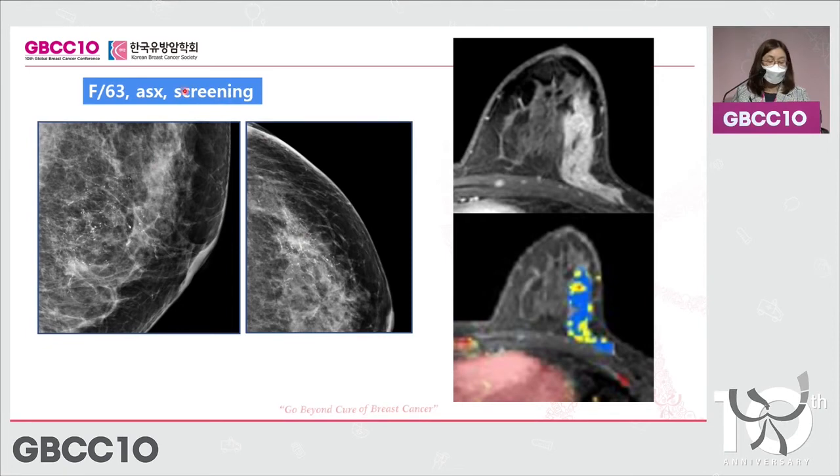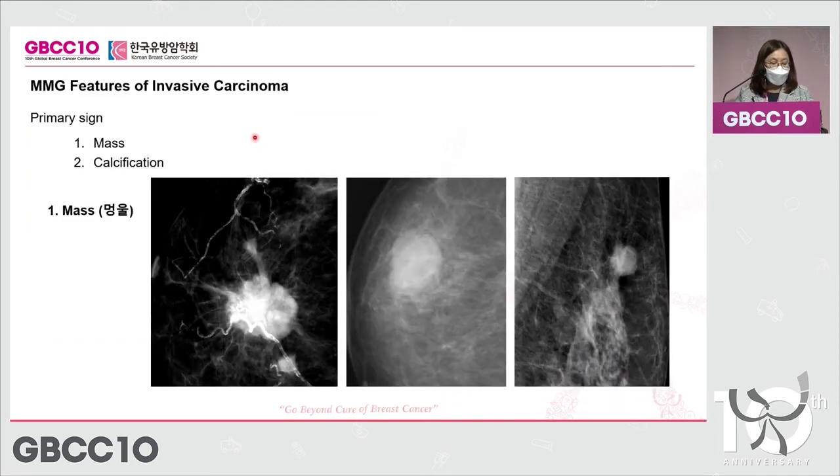A patient comes for a workup, and we see that there is calcification, but this was not shown in the ultrasound. So we wanted to see if this person had only microcalcification, and we were able to see that we had a carcinoma in situ, a DCIS, in probably a third of the breast. So you will have to go through the whole work-up to come up with a result.